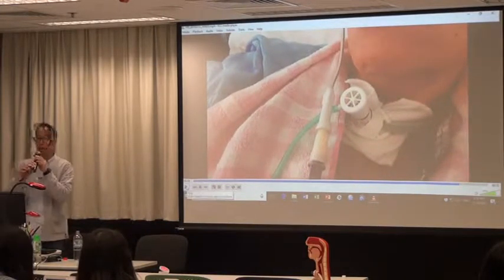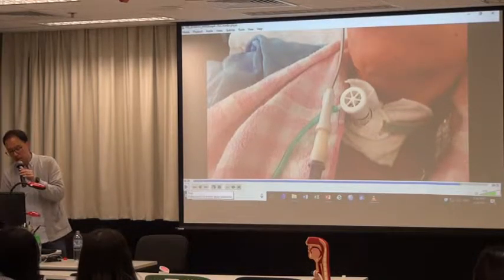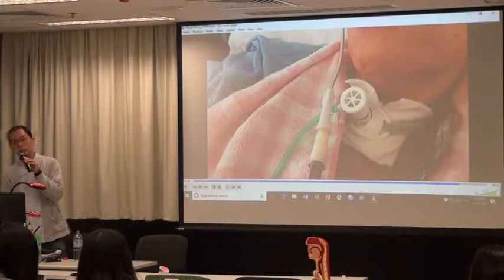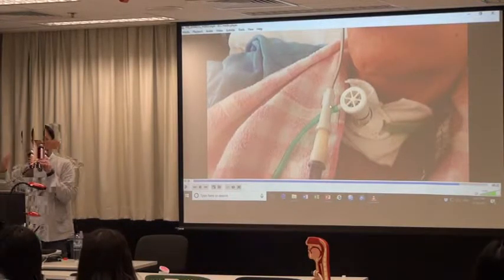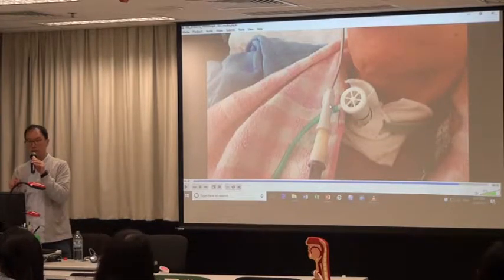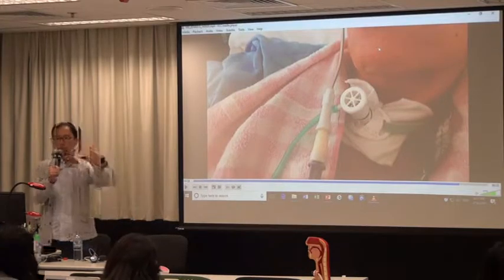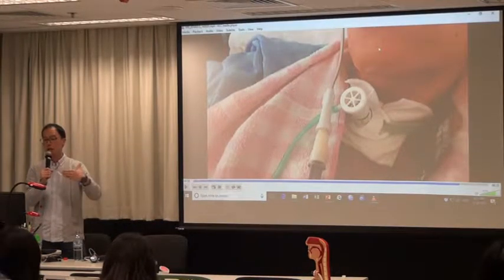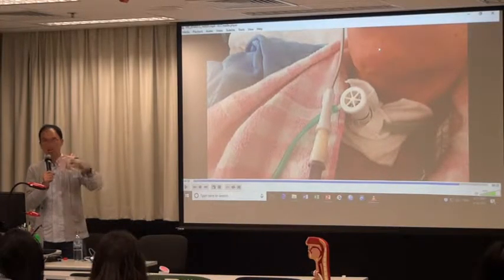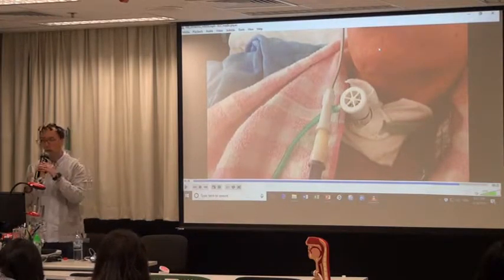Okay, you hear the cough sound. Okay, so the patient was able to cough. It doesn't come out that easily. Okay, so this is the advantage of using a speaking valve. This valve is connected to the oxygen port as well, so oxygen can flow directly to the tracheostomy with this speaking valve. Okay, but if the patient doesn't have this model, he or she can still use the tracheal mask. Okay, putting the tracheal mask on top of the speaking valve still works because it doesn't limit inhalation.